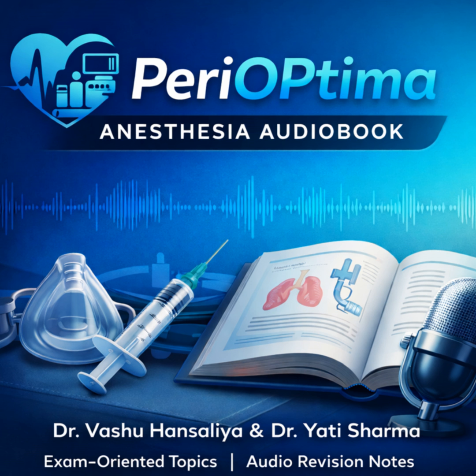Okay, good. Now let's get into the machine's internal defenses. The hypoxia prevention device. This is a huge topic for the MD exams. What's the core principle? The core function is to keep the inspired oxygen fraction, the FiO2, above a safe threshold, usually around 25 or 30%. And an MGPS failure usually shows up as a pressure drop.